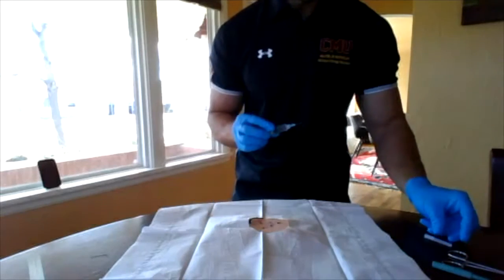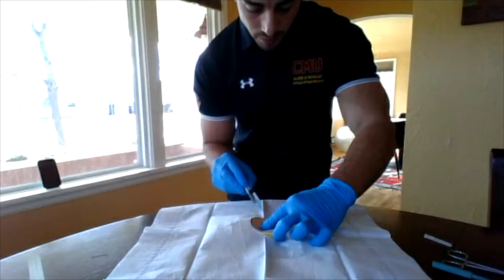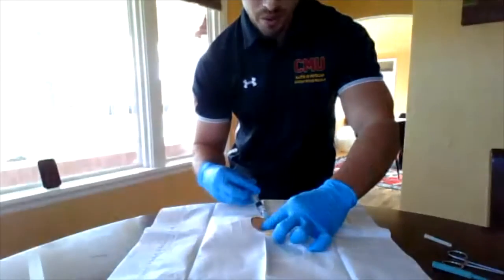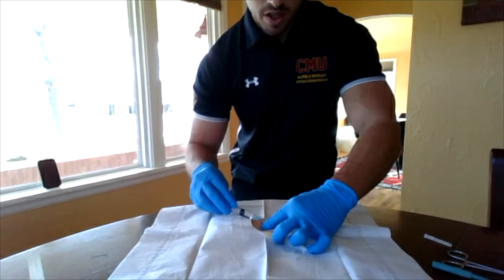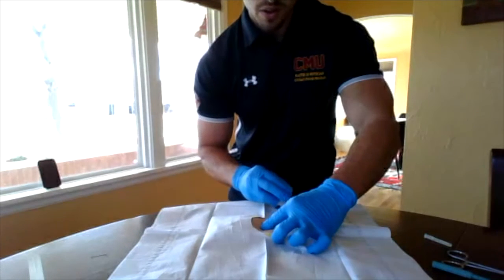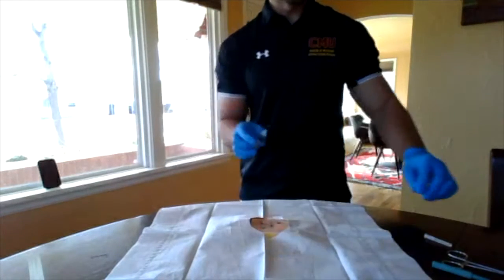So with bevel up, try to get into the subcutaneous tissue. Then as you're pulling back, continue to inject, change directions, continue to inject, change directions, continue to inject. All right. So now pull it out and we'll recap our needle.